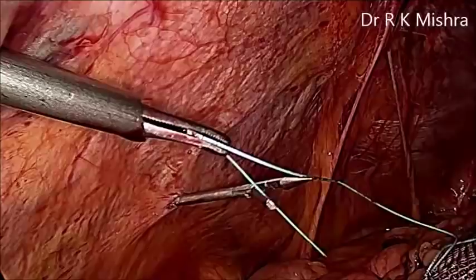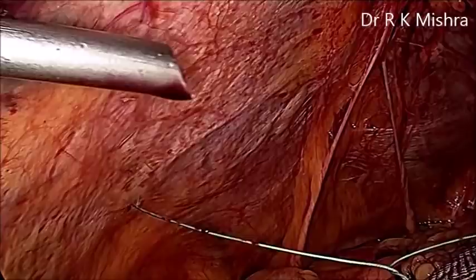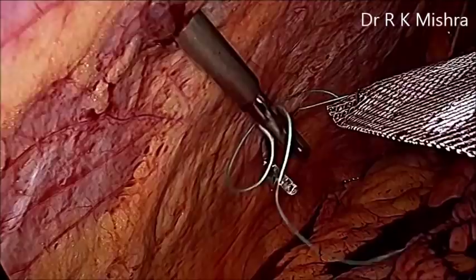You have to give the choice to the patient, and generally we prefer to have a composite mesh. There are biological meshes also, but synthetic coated meshes are more preferred because they are more stable and less allergic to the human body.